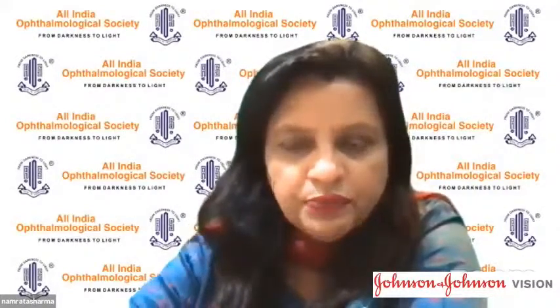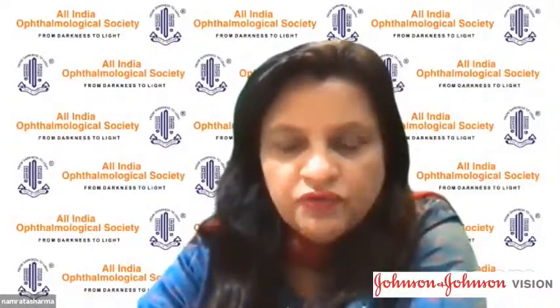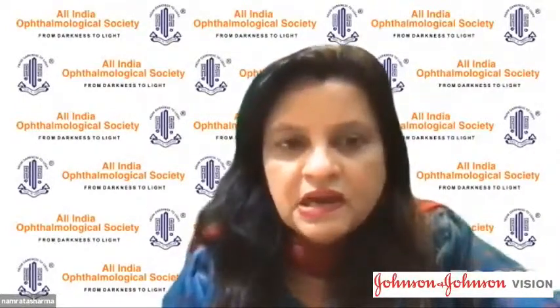Dr. Namrata, you have been doing glued IOLs? I think that was a great presentation, Ashwin, and you showed all the situations very well. We are doing glued IOLs with just one small modification: instead of the scleral tunnel that we make, we dissect it out with the help of the crescent. So it's a larger surface area in terms of width as compared to the tunnel. The advantage is that the haptics of the lens just go inside and abut it without having to be directed. But both ways it can be done, and plan B always has to be kept in mind whenever there is an untoward event.